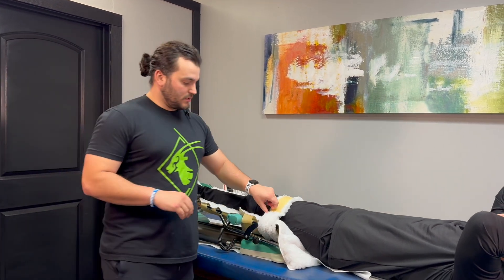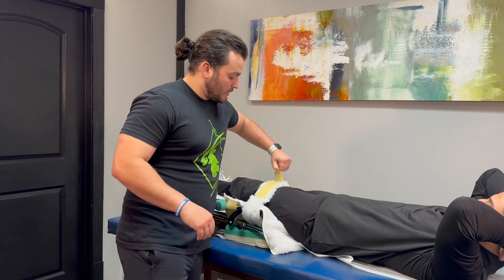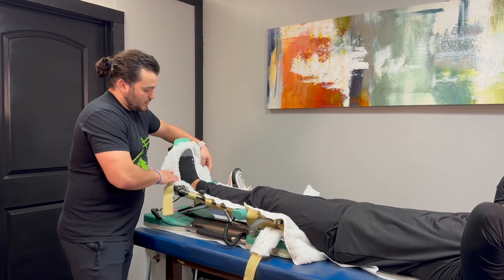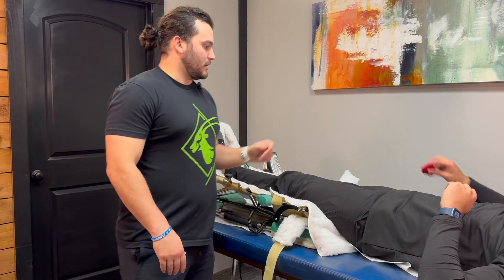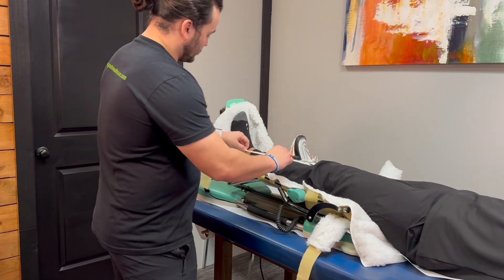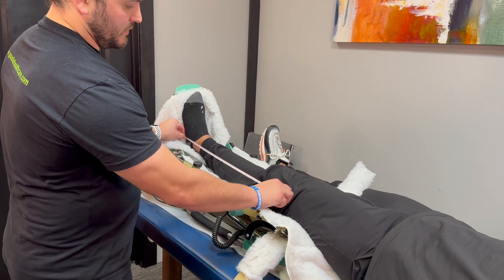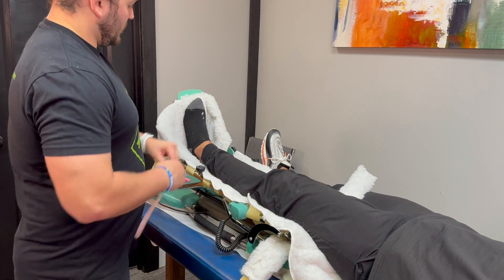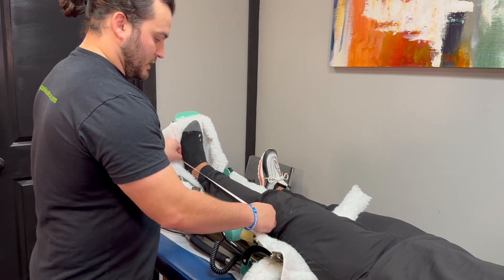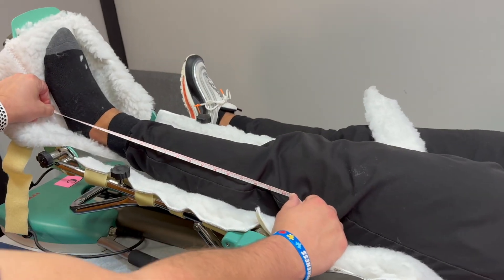There is another way to measure the fit if the patient is not able to get up on a table or down to the floor. You measure from the bottom of the patient's foot to the dead center of the knee. Just grab your tape measure — put zero at the bottom of his foot and come up to the dead center of his knee. If he measures 20 inches, put that zero at the very end plate of the CPM and the 20-inch mark should be directly in the center of the hinge. That is how you can fit the patient in the CPM.